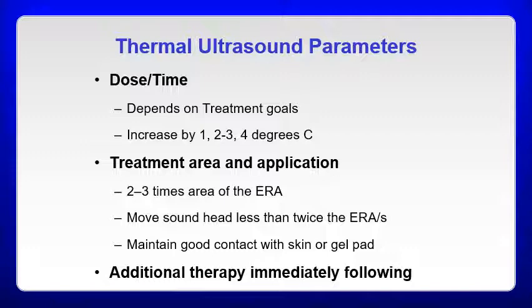And then again, any additional therapy, this is what I was getting at with the stretching window, you want that to be done immediately following the treatment. So your stretching window is approximately 5 minutes. So you don't want to have them wait after you do your ultrasound to do your mobilizations or what have you. You want to perform that immediately after you're done.